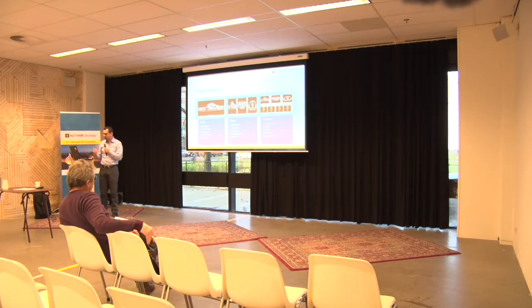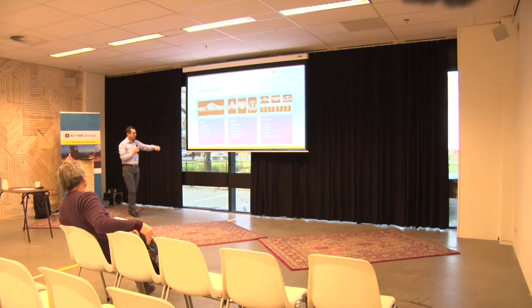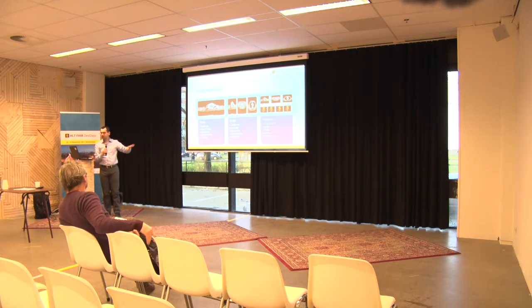And of course, at each level, it stores information that is relevant. So for example, for the study, it's the date of study, the description, which typically is mapped to the procedure code, and things like that. Any questions about this before we leave it? Okay.